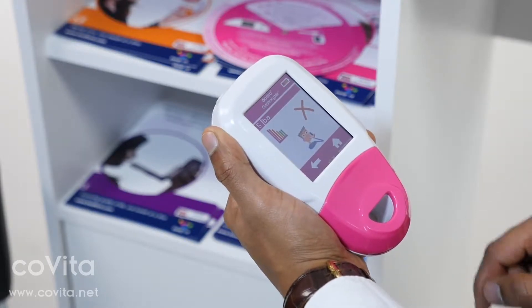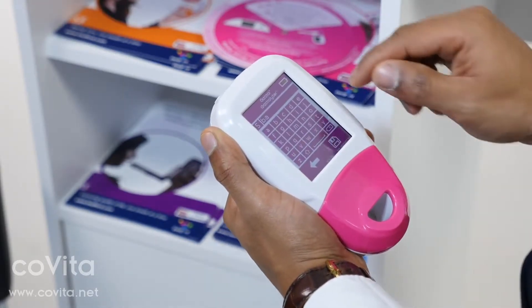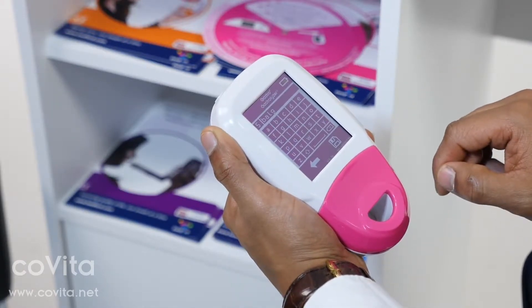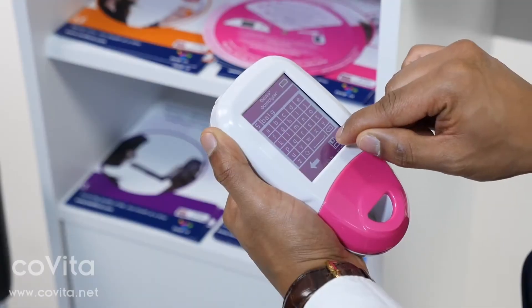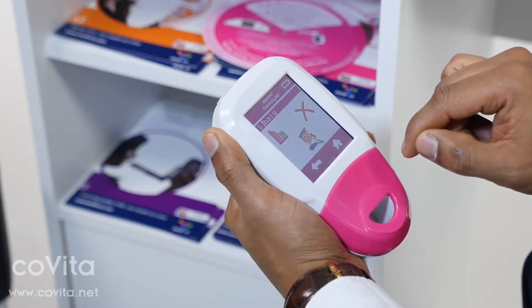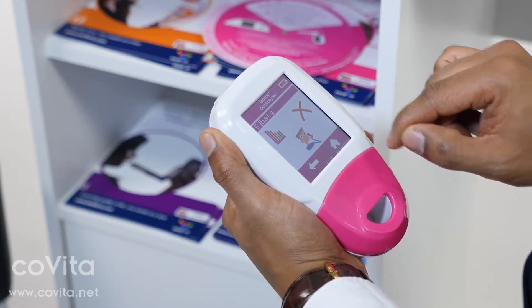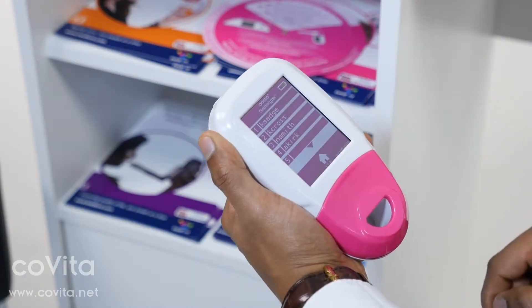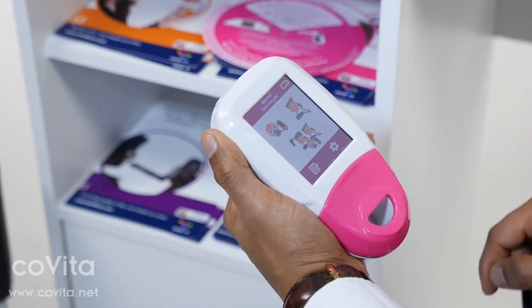To change their name, click on their name at the top of the screen and use the keypad to edit. Once you are happy with the changes, click Save to register them or the back arrow to cancel. To delete a patient, simply click on the X whilst on their patient profile and click X again to confirm.